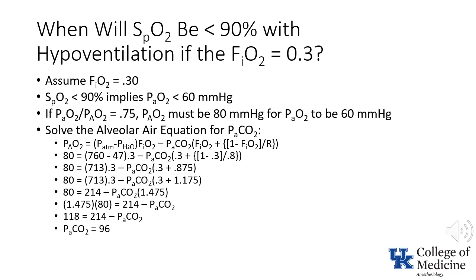That having been said, in my opinion, it's more realistic to use an AA ratio of 0.75. Sedation will likely result in a decrease in tidal volume with consequent atelectasis, producing an increase in intrapulmonary shunt fraction and thereby a decrease in the AA ratio. The bottom line is that the pulse oximeter is a poor monitor to detect hypoventilation.